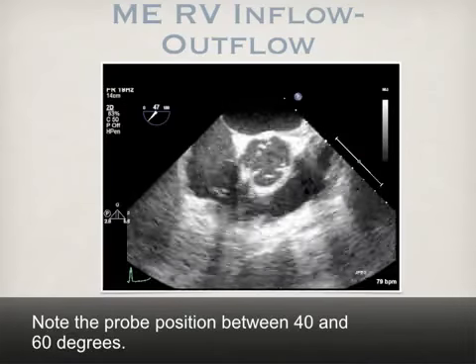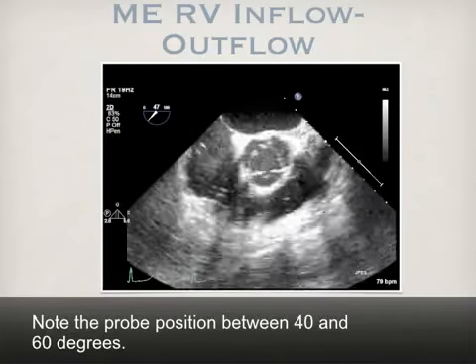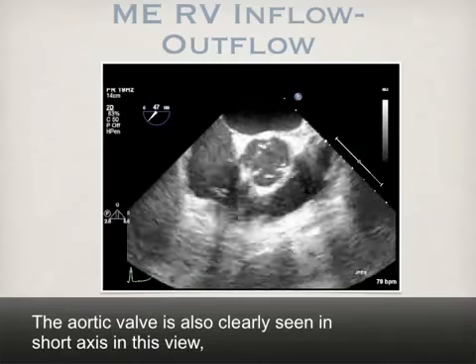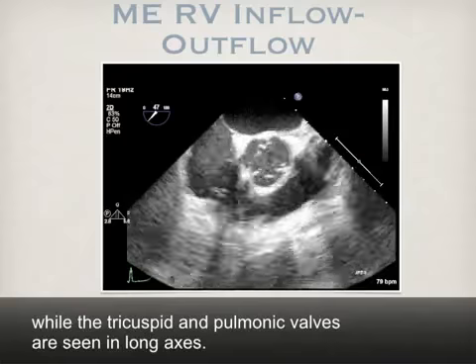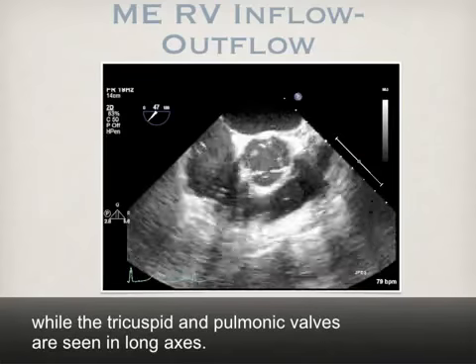Note the probe position between 40 and 60 degrees. The aortic valve is also clearly seen in short axis in this view, while the tricuspid and pulmonic valves are seen in long axes.